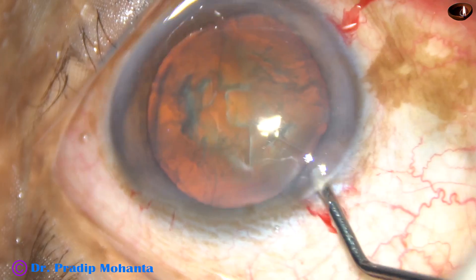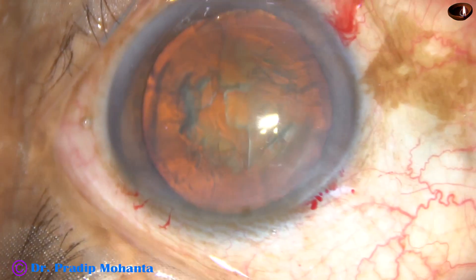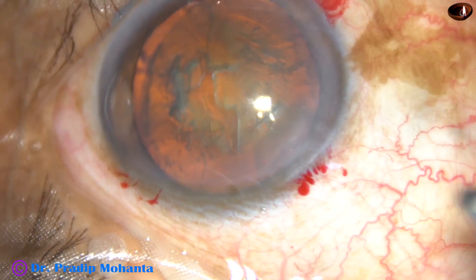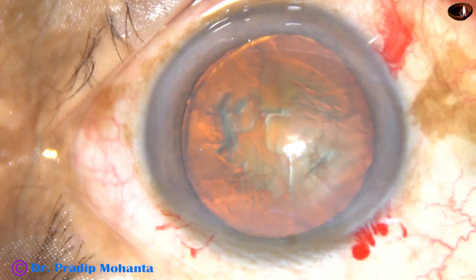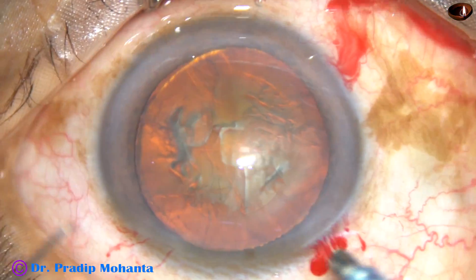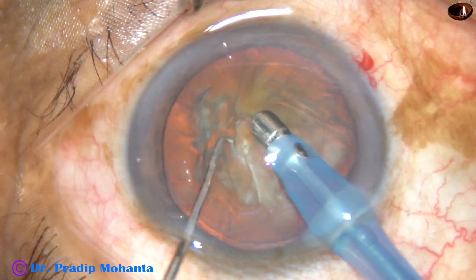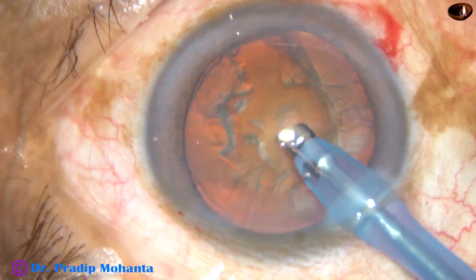Visco again. 2% hydroxypropyl methyl cellulose is injected again into the anterior chamber. Now is the time to introduce the phaco handpiece into the anterior chamber. The machine being used is the Alcon Infiniti Catarix 3, which is a very good phaco machine. Some superficial cortical matter is removed.